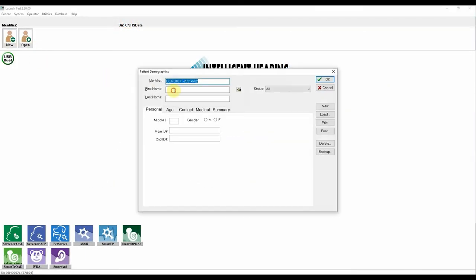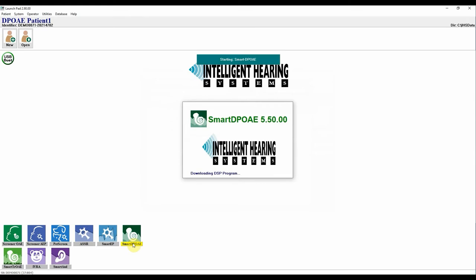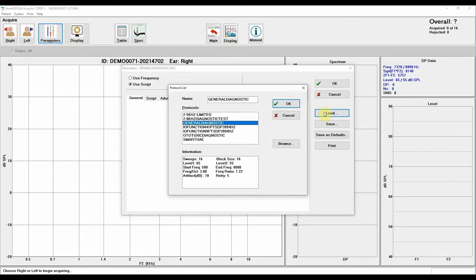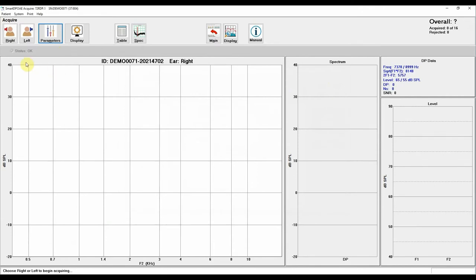Now I'm going to walk you through a Smart DPOAE test. First, enter the patient information from the patient menu on the launch pad. Then launch the Smart DPOAE software module. Click on the Acquire button to enter the testing screen. Select Parameters and click on the Load button to view the list of protocol parameters you have previously programmed. Choose your test protocol by clicking on it until it highlights in blue. The bottom panel will show a summary of the acquisition parameters. Click OK to use that protocol for testing. Next, place the probe in the ear and click on the test ear button corresponding to the ear where the probe has been placed. In this example, I have placed and initiated the test in the left ear.